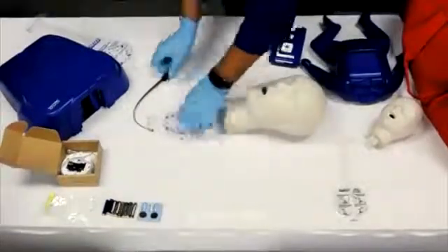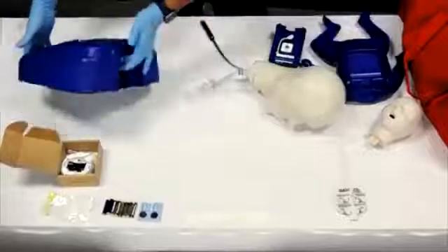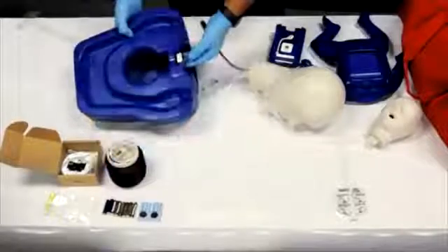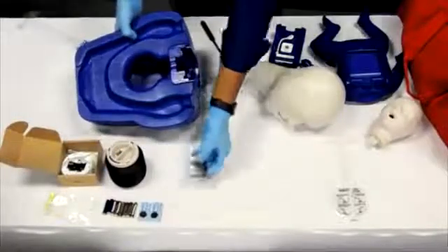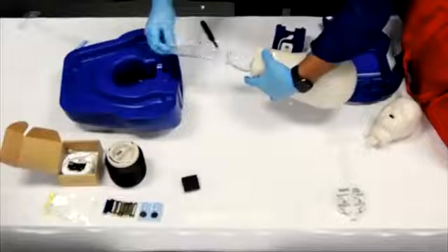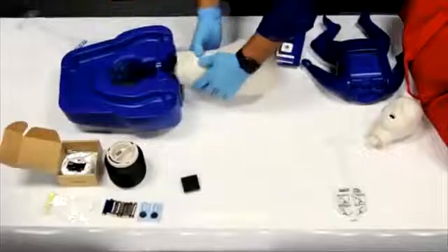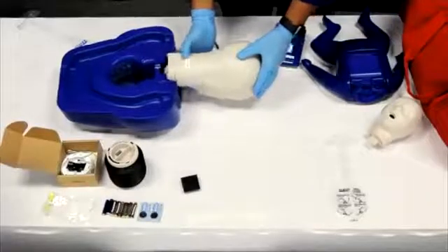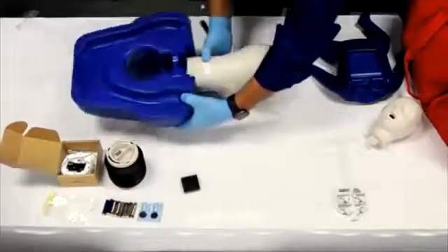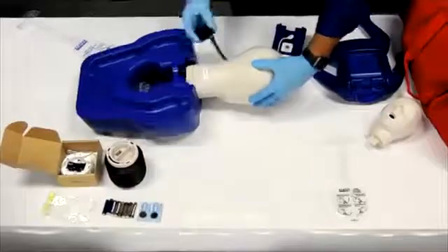Now we can attach the head to the torso. Please flip the head over and then pull the piston out of the bottom of the chest cavity. Remove the black neck lock device from the brace. While holding the head, pull the lung bag through the opening of the neck brace. Lay the bag flat and centered in the chest cavity. With the head facing down, line up the 2 pins on the head with the 2 slots on the neck brace. Push the pins until they slide into the slots and the head drops into place. And then replace the neck lock device.